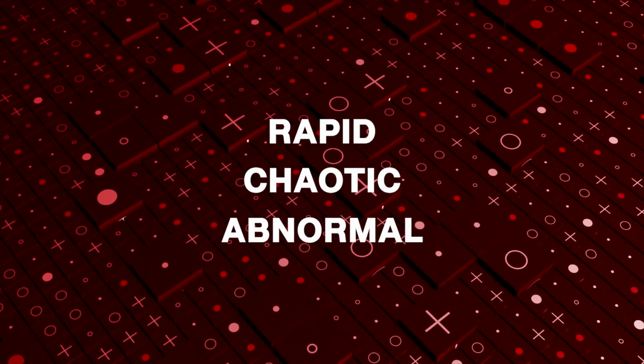So if it determines a condition where the heart's electrical impulses are rapid, chaotic, abnormal, it will push an electrical shock to help restore a normal cardiac rhythm. So that's exactly what the machine does. It restores a normal cardiac rhythm because the heart's current rhythm is abnormal and chaotic, right? It's firing from all over the place.